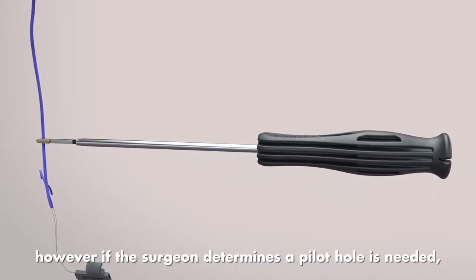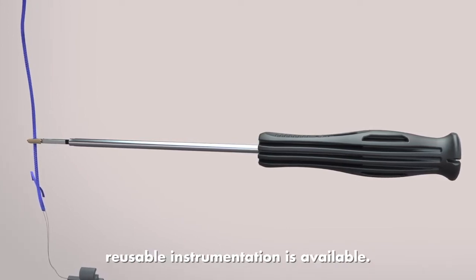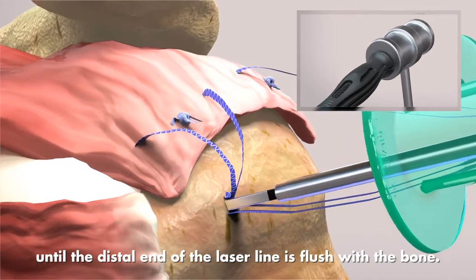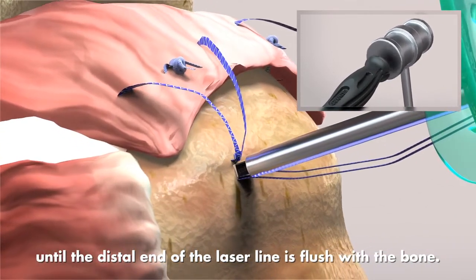The eyelet inserter is self-punching; however, if the surgeon determines a pilot hole is needed, reusable instrumentation is available. Mallet the proximal end of the eyelet inserter until the distal end of the laser line is flush with the bone.